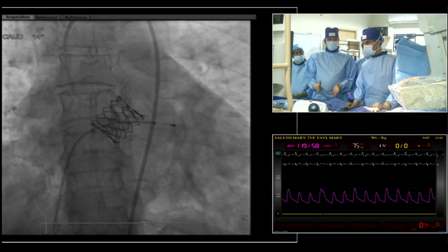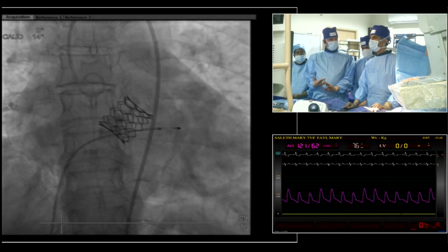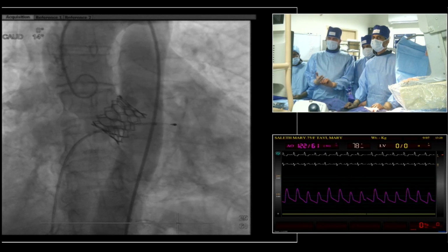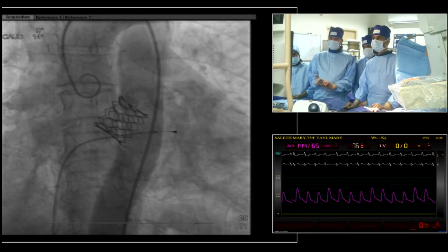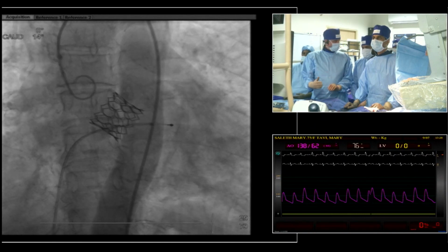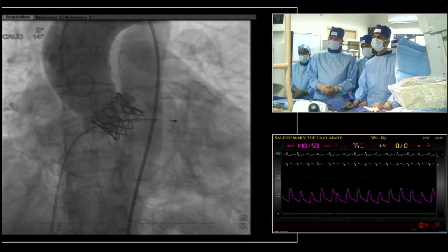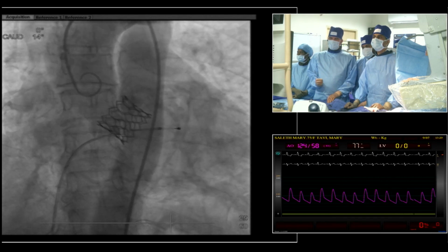So we've seen a very nice demonstration of TAVI in a patient with a bicuspid valve, 75 years of age, with a low left main stem. We had quite a difficult job in crossing the valve. Sengo did that very skillfully. We then undertook preliminary balloon valvuloplasty with an 18 millimeter balloon and deployed a 23 millimeter MyValve device with a long pacing run, a very slow implantation, and doing that we achieved a very nice stable position and a very nice lasting result here. We've got minor partial left bundle branch block with a QRS of 140.